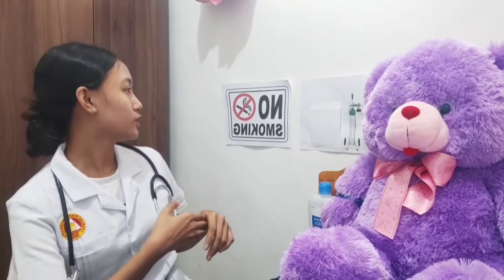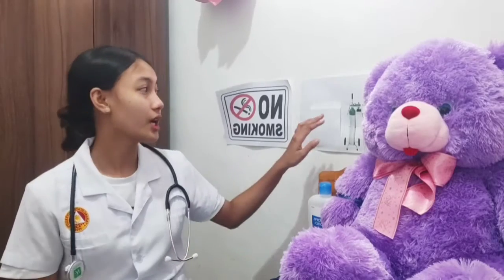The no-smoking sign is posted to avoid any kinds of complications. After that, for implementation and preparation, we determine the need for oxygen therapy and verify the order for the therapy.